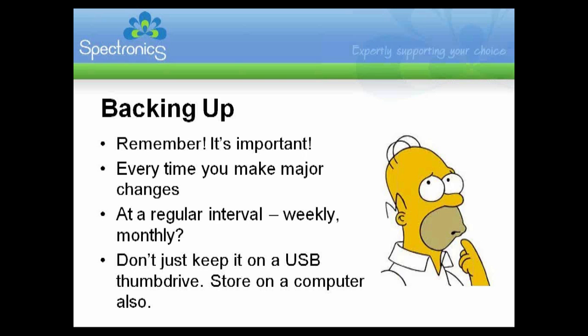So make a copy or drag it across in your Explorer on your computer, but don't just keep it on that USB stick, because it's really easy to lose the USB stick, and it's also easy for a USB stick to become corrupt. So you almost need to back up your backup just to make sure that you've got one. I've come across many a user who's called and said, we've got a problem with the device, but we didn't do a backup. And yeah, it's pretty devastating when you've done lots of changes.